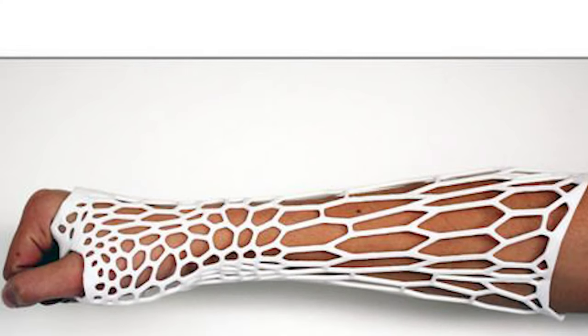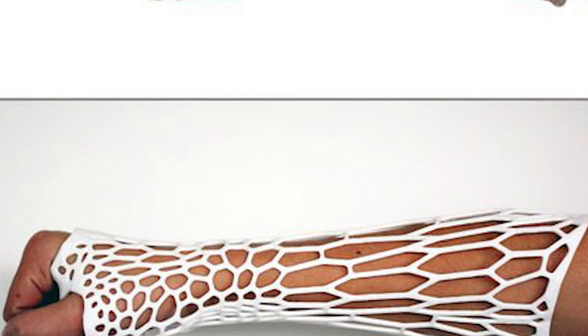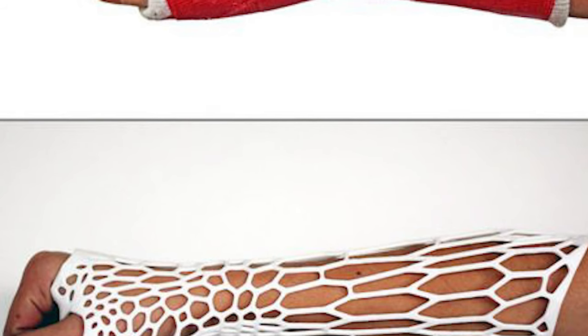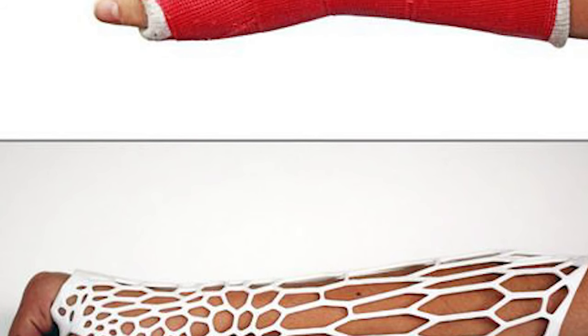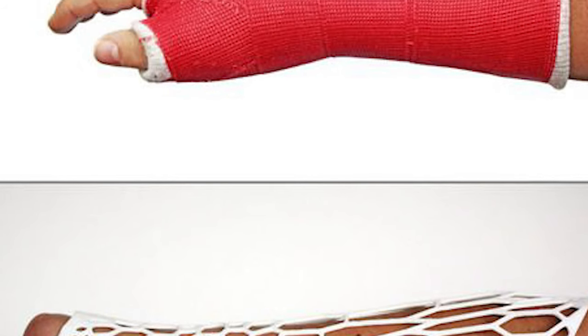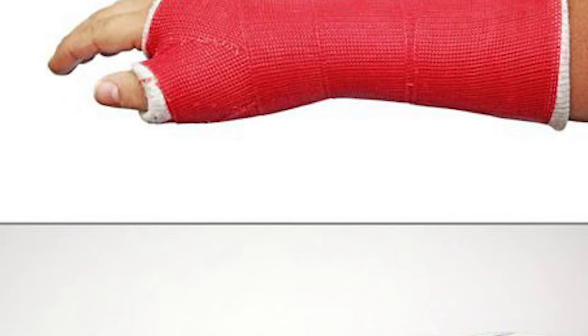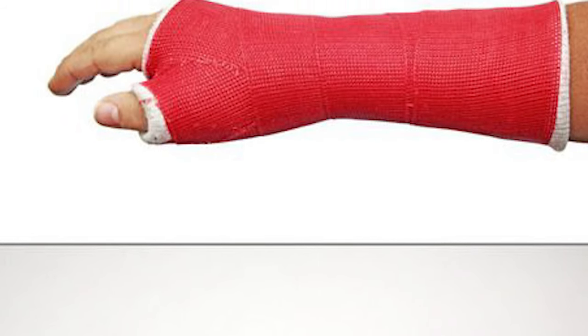On the downside, there is less data on the effectiveness of the use of 3D printed casts in treatment of injuries compared to using plaster. Even now, with more research being conducted on 3D printed cast treatment, medical consensus is yet to be reached. For this reason, the technology has not yet become widespread.